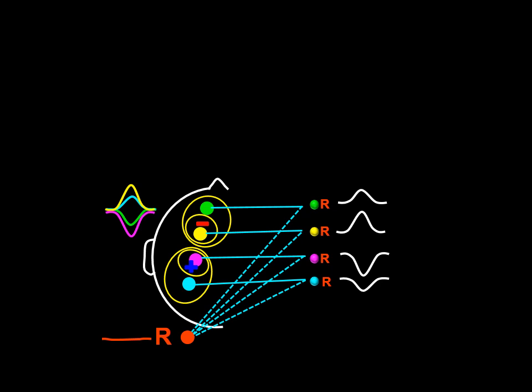And you can also see in this frame its corresponding waves. Please notice the phase reversal between the yellow and the magenta electrodes. The reference electrode is at a neutral voltage, neither negative nor positive, or at least it is at a voltage that is less positive than the voltage of the blue electrode and less negative than the voltage of the green electrode.